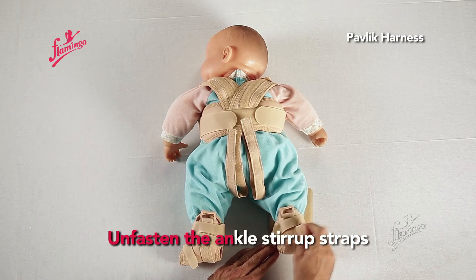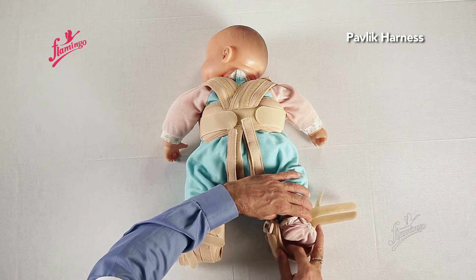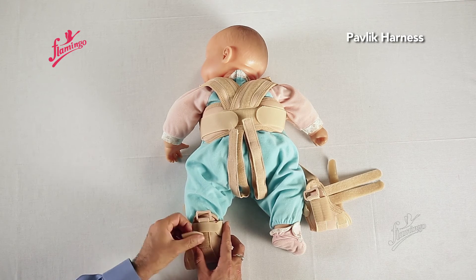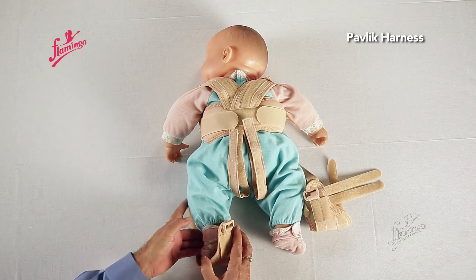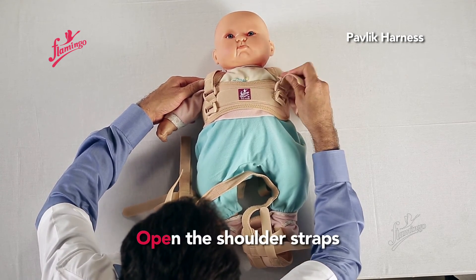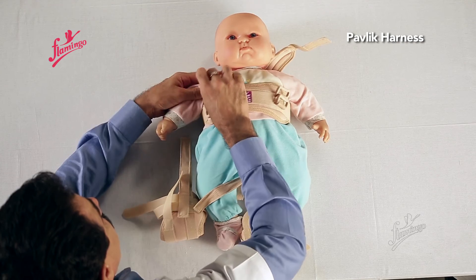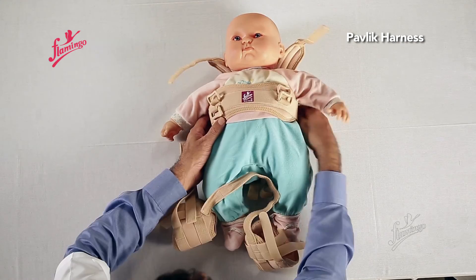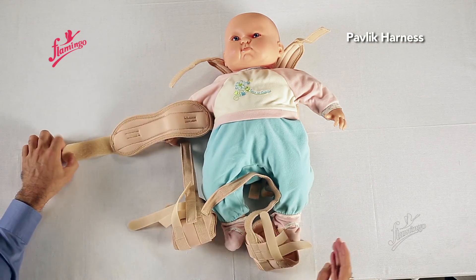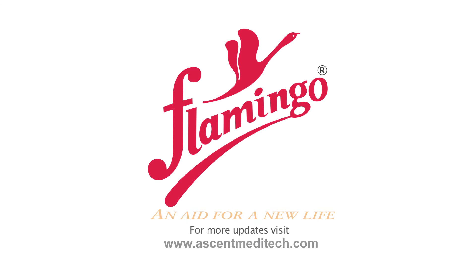Unfasten the ankle stirrup straps. Turn the baby back gently facewards. Open the shoulder straps and release the chest halter.